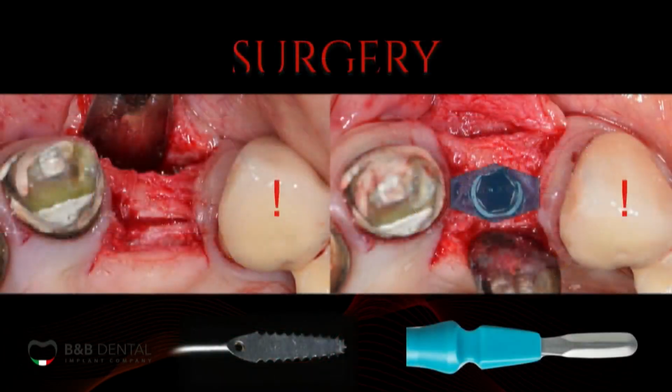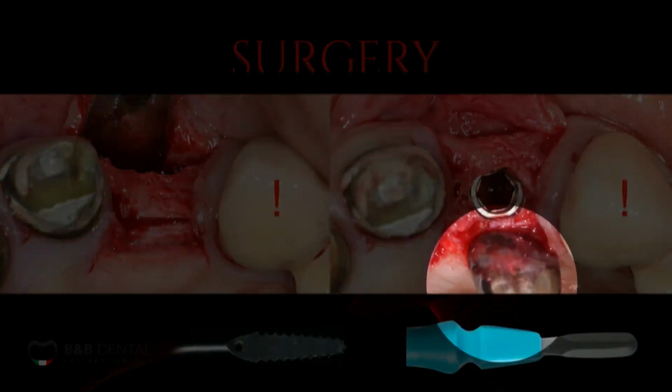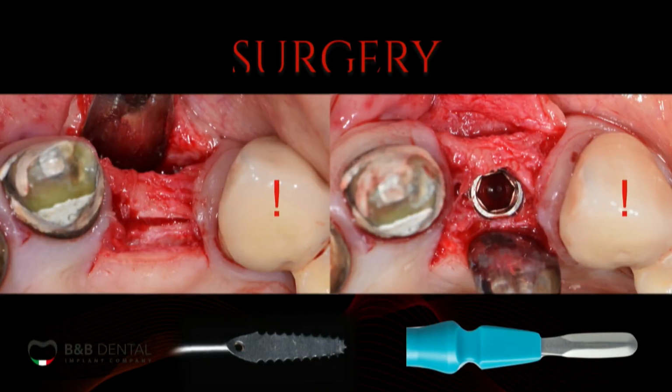Of course, by using the split crest, which is described in the literature as a surgical procedure that allows us to split, to open the two corticals and separate them like a bone fracture, and to allow the blood to form the clot and to form new bone just between the two corticals that we have separated.